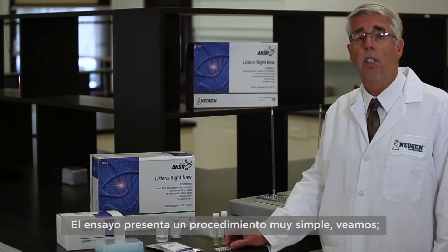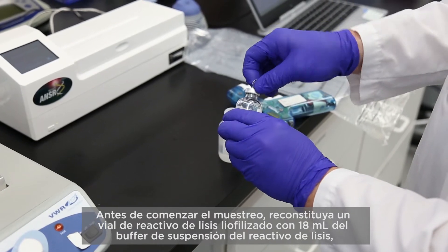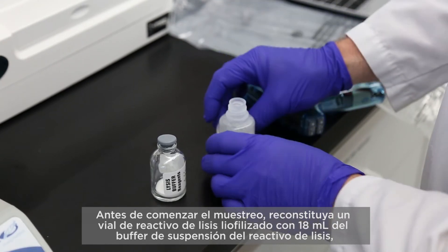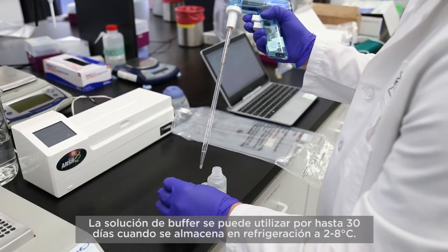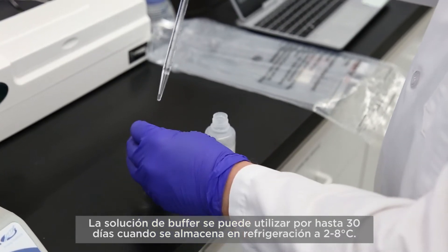The assay features a very simple procedure. Before beginning sampling, reconstitute one vial of lyophilized lysis reagent with 18 milliliters of lysis reagent suspension buffer by adding the buffer to the reagent vial. The buffer solution can be reused for up to 30 days when stored under refrigeration at 2 to 8 degrees Celsius.